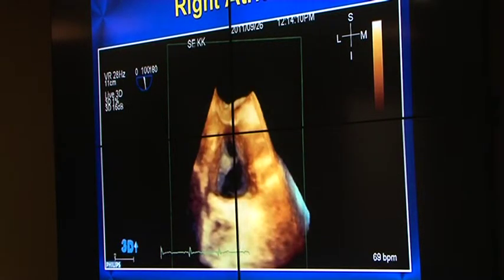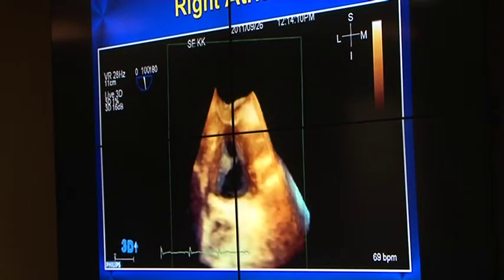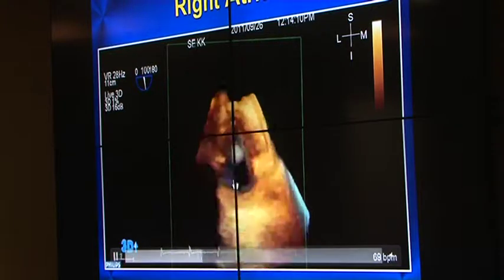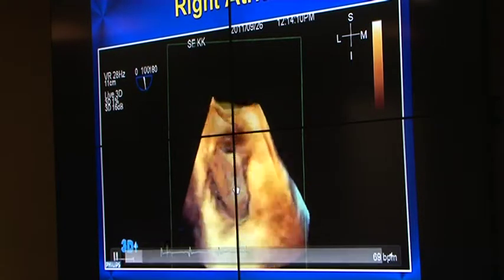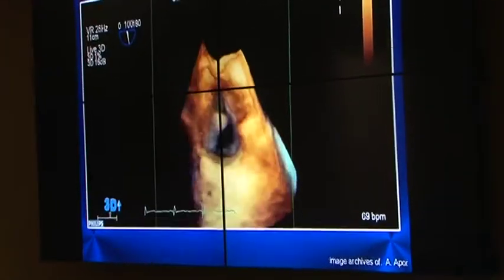No? It's a thrombus. And how was it defined? We just see it first time. So it's a very large thrombus moving in the right atrium. The length was almost 15 centimeters and the width was 1 centimeter. So it looks like my thumb.